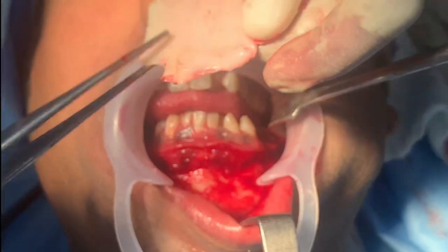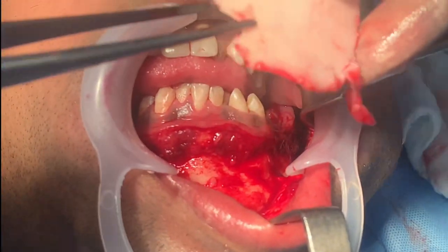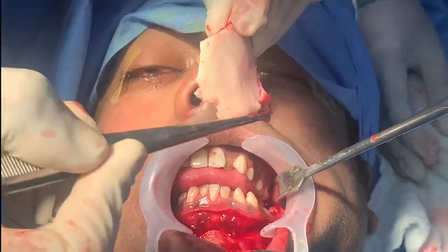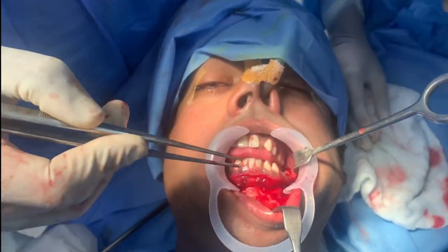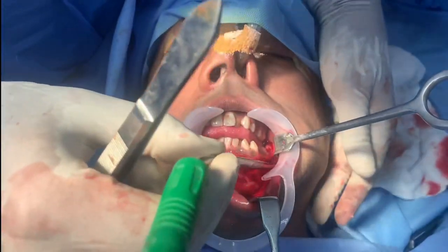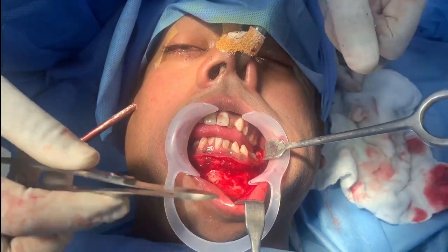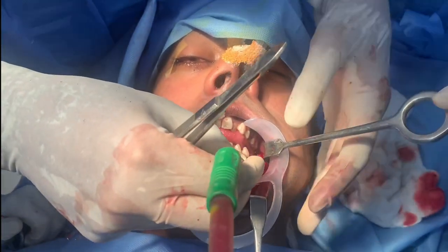So this is the bone — right from inside — and that's being removed. You can see the bend which was preventing the face from being narrower. That's a huge bend — about five to seven millimeters outside. We've taken it off. I've also done a lot of osteoplasty. Osteoplasty is smoothening the bone; osteectomy is cutting and removing, like what I did there; and osteotomy is making a cut and fracturing the bone and moving it to a new direction.